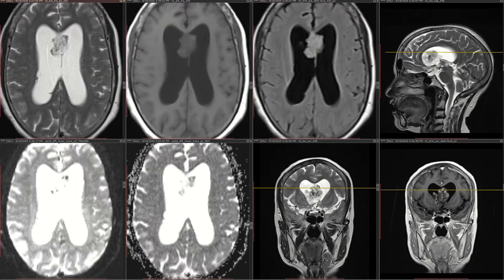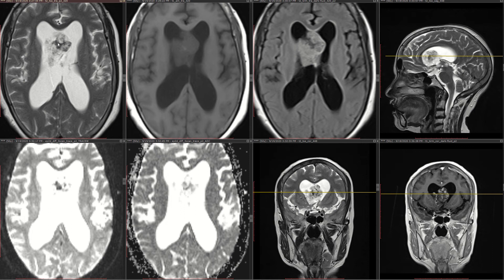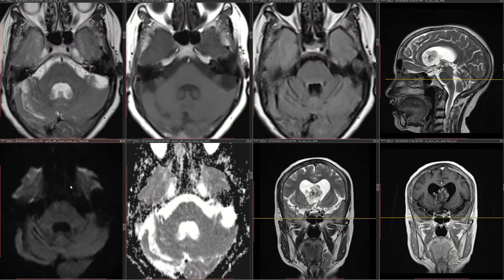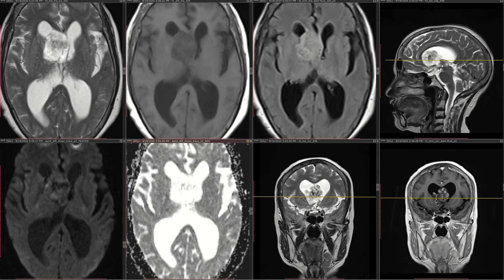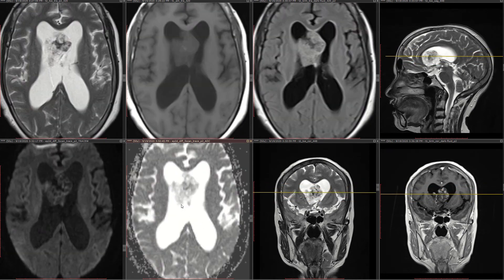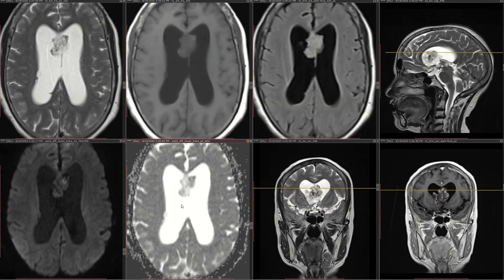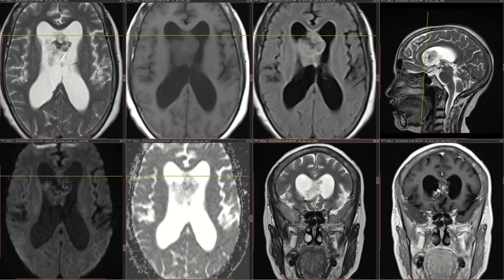The signal here is heterogeneous — a few T2 high signal spots are seen within it. If I scroll to check whether there is any diffusion restriction, there is no diffusion restriction per se within the lesion.